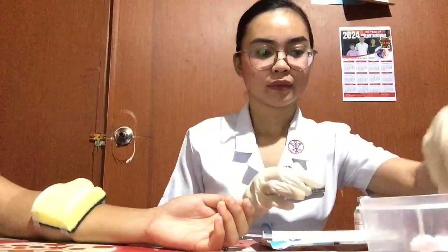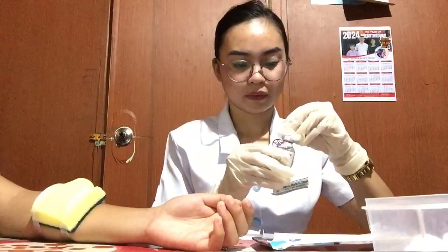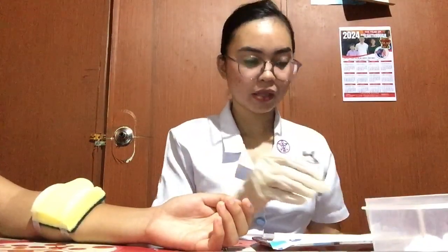Now remove the protective cap, or clean the rubber cap of a previously opened vial with an antiseptic wipe by rubbing in a circular motion. The antiseptic cleans the cap and reduces the number of microorganisms. And discard.